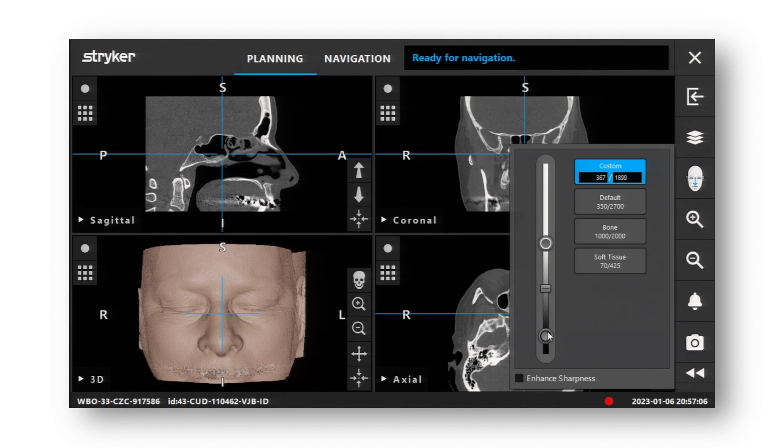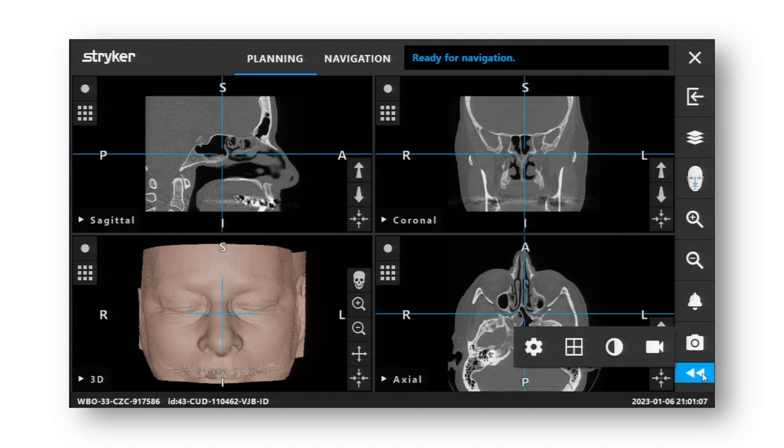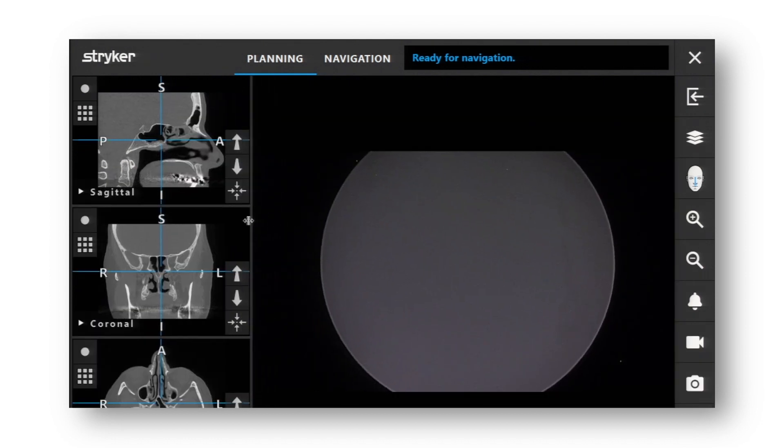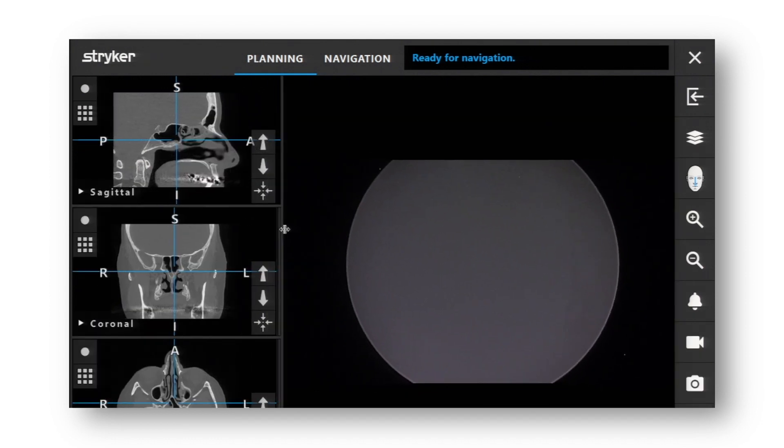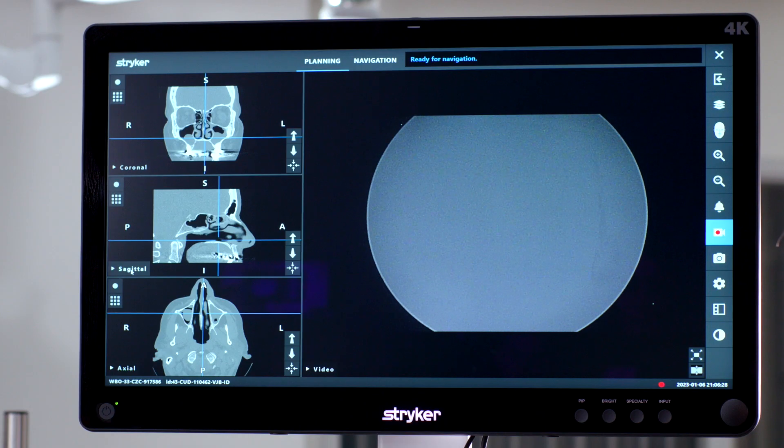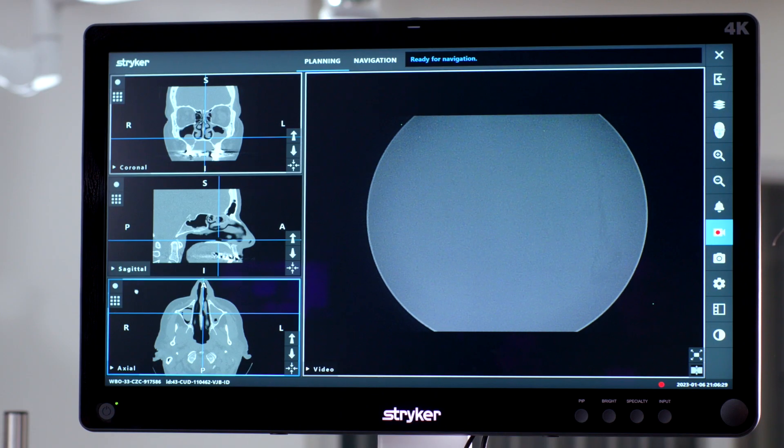With Scopus, personalize your screen layout with the screen configuration tool. Choose from a collection of layout templates, then easily adjust individual display view sizes and drag and drop the panes to your preference.